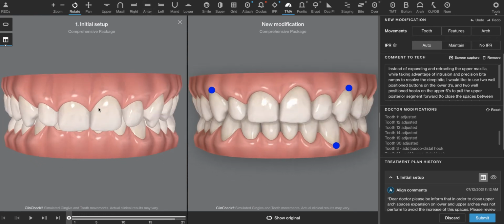That's pretty much it. Maybe just a little comment about delayed passive eruption. Teeth always erupt actively through the bone first, and this is during pre-adolescence when these teeth are erupting. Then the tissue retreats backwards, or the teeth don't actually erupt any further. They appear to erupt more as the tissue recedes.